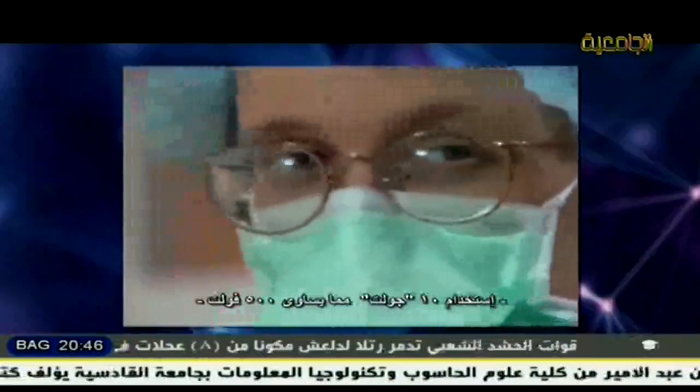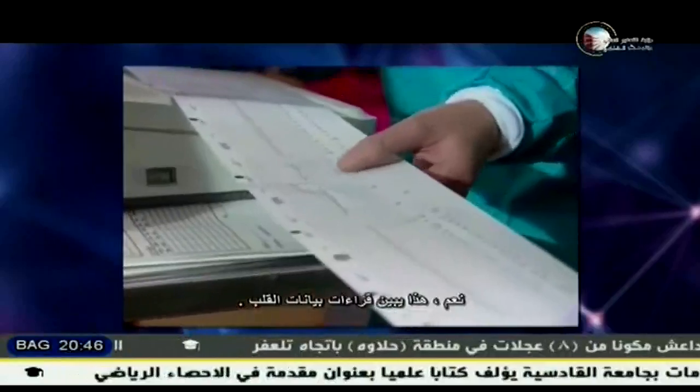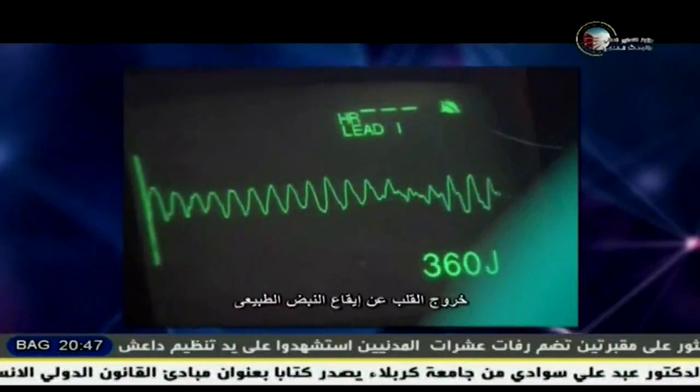When we were putting in the defibrillator is when we induced this ventricular fibrillation, this very fast heart rhythm. You saw a lot of very rapid squiggles on the screen, and that was the heart beating very, very chaotically with multiple short circuits swirling around the heart, resulting in the heart beating 400 or 500 beats a minute. So 10 joules, which is about 500 volts.